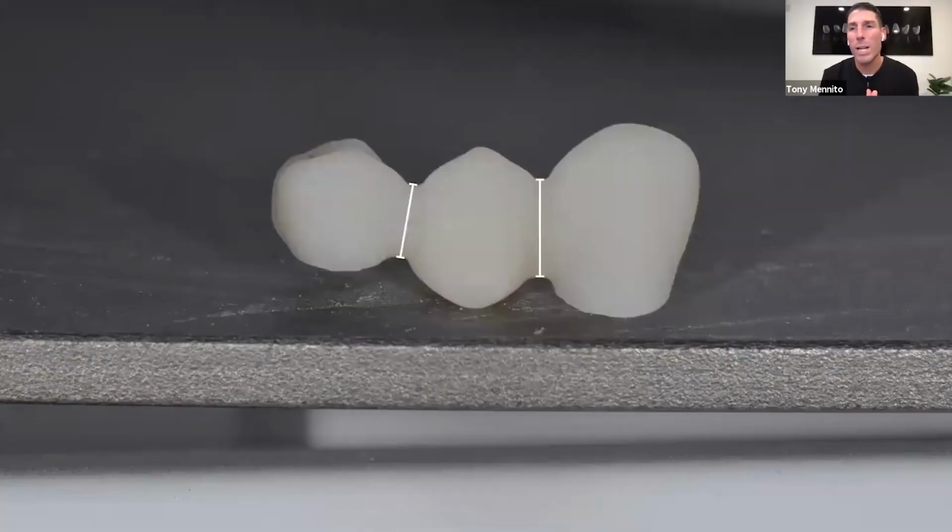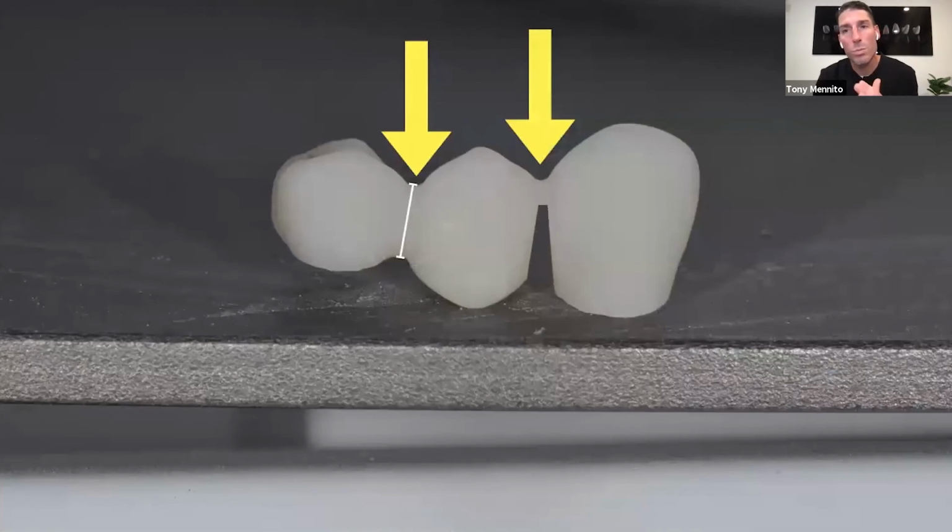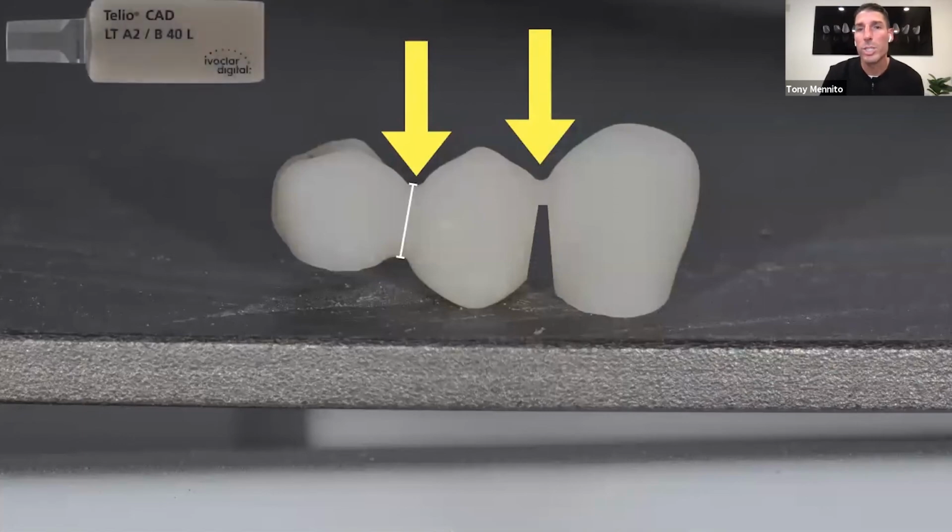And the one thing about anytime you mill bridges, so this is one thing I wanted to hit on briefly. You mill a bridge, you got to be really careful about connector thickness. And if we all want them to look nice, sometimes we'll use a disc to open up those embrasures, but you got to be really careful because the occlusion is coming down generally on those marginal ridge areas. And if you go haywire with your disc into those embrasures, you can really cause some issues.